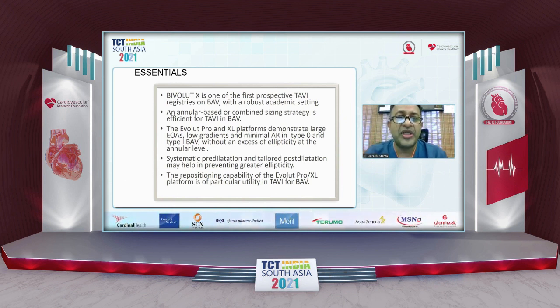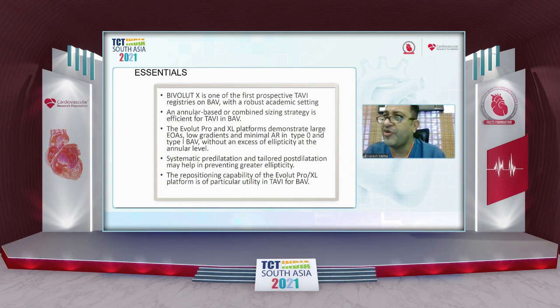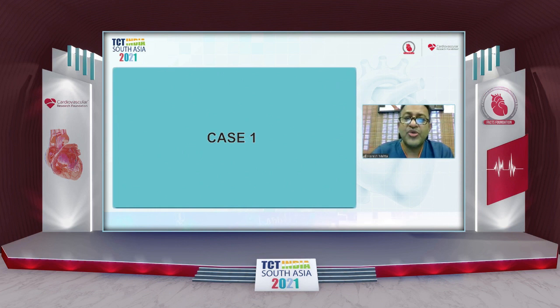And the important thing, it showed us systematic pre-dilatation and tailored post-dilatation helps in preventing ellipticity, and repositioning capability of this valve is of particular utility in TAVI for BAV. I'm going to show you just a couple of cases.